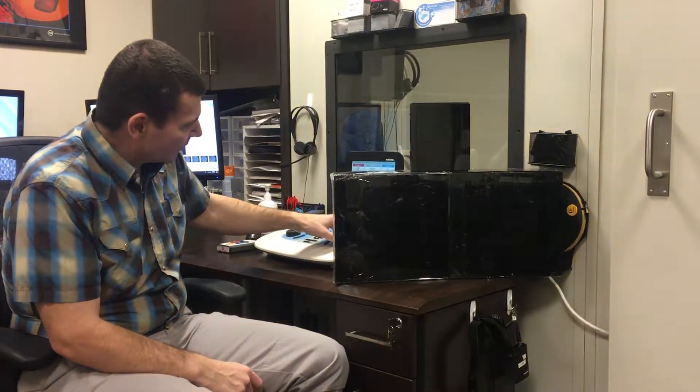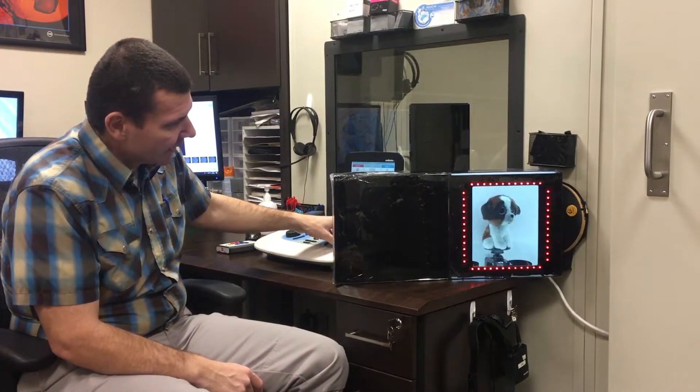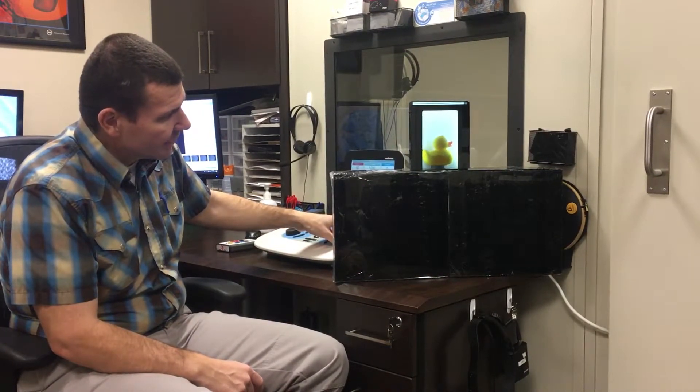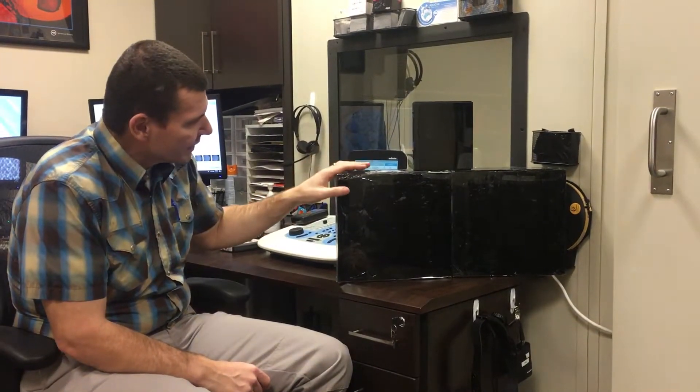And just one more time so you can see that. We're going to go left, right, left, both — and there's the centering toy.